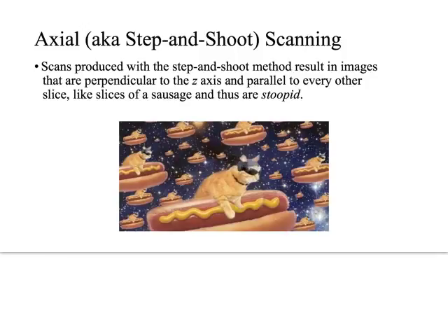And the benefits that she outlines that they give us in terms of increased spatial resolution and things like that have largely been made obsolete by increasing progress in software development. So why am I harping on this so much? Why did I put all these cats in here? Is it just because I'm sick of being called a CAT scan technologist? No. It is because we are still doing this.